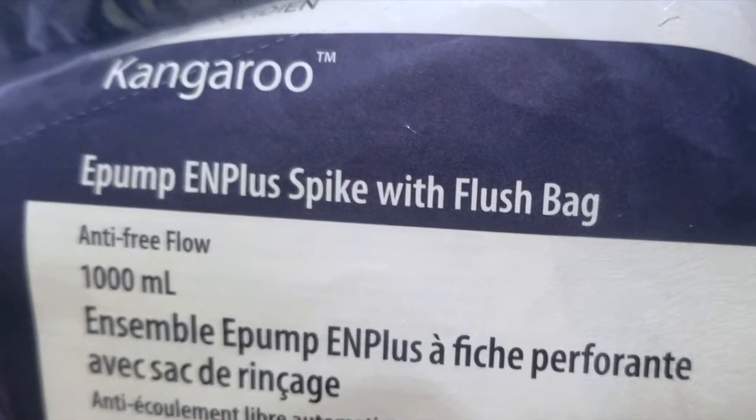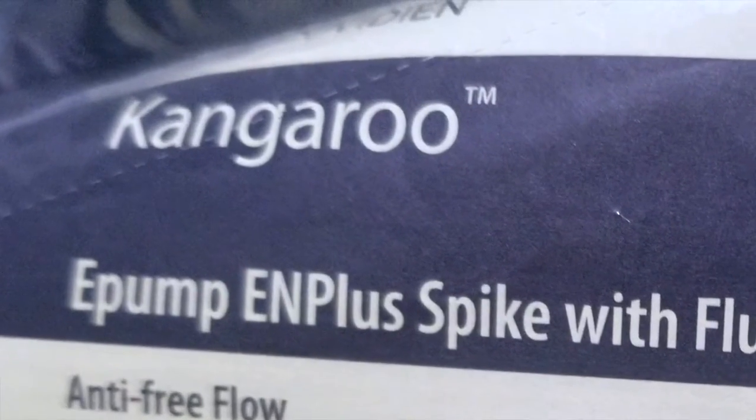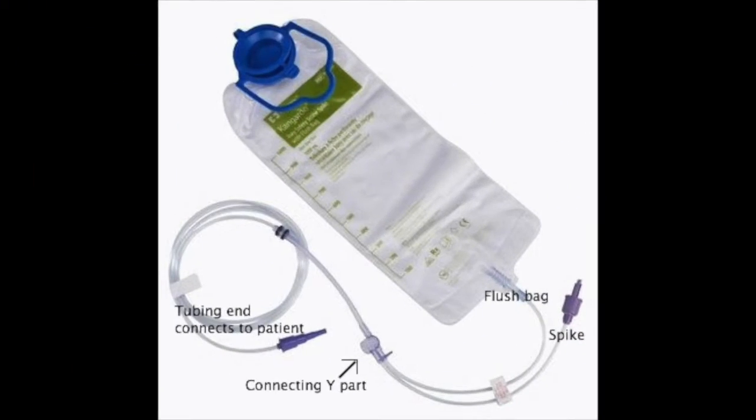The Kangaroo pump is what my institution uses and this is what the packaging tubing looks like. The connecting part is formed into a Y, with one end to a 1 liter flush bag and the other end to a spiker to spike your formula bottle. The other end will connect to the patient's tubing.